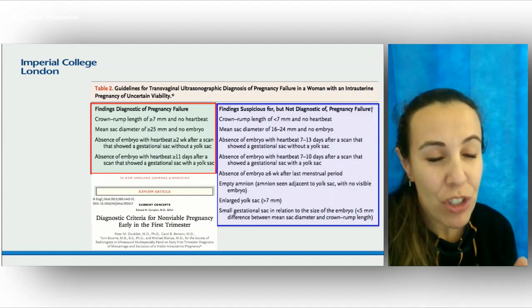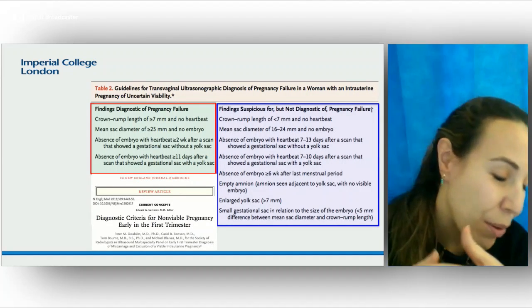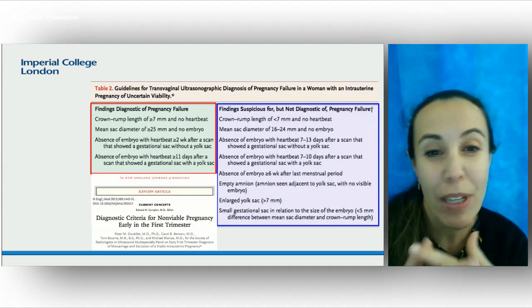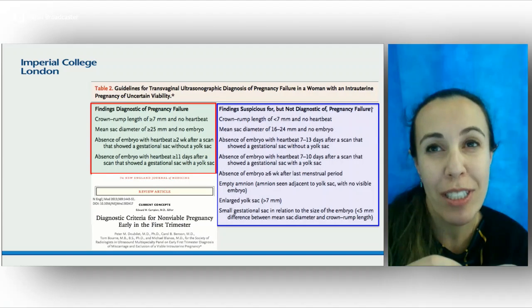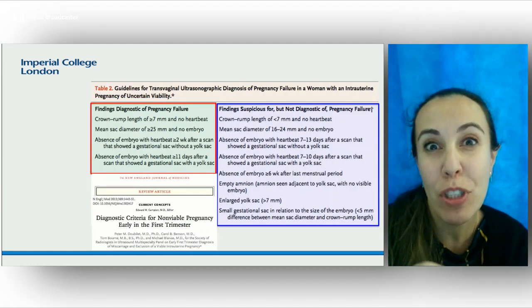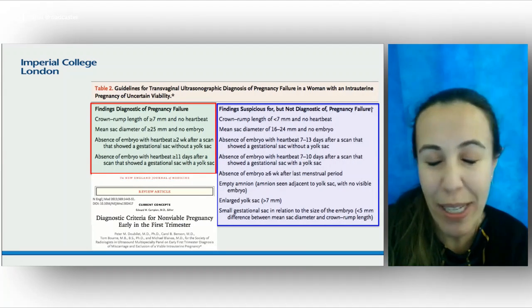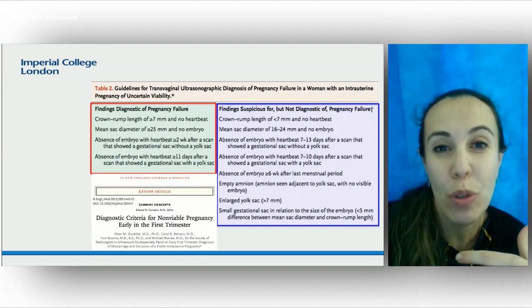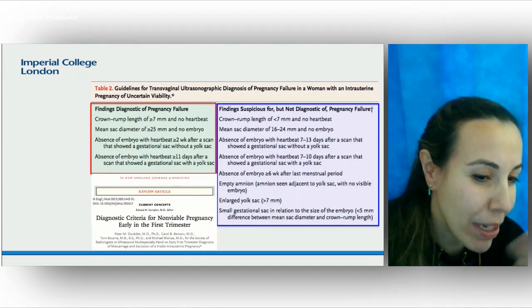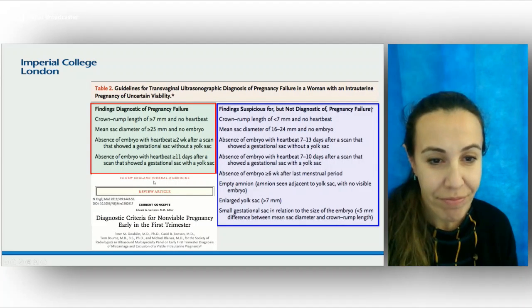It was an interesting question from the audience about transvaginal ultrasound, because all of these guidelines and rules in these papers have all been created for transvaginal ultrasound. So when we are using transabdominal scan, obviously our images are not going to be quite as good. So where there is doubt, it's so much better just to bring the patient back and leave an even longer gap. So where possible, 2 weeks. That would be my general feeling. I think you might agree, Alex. Yeah.